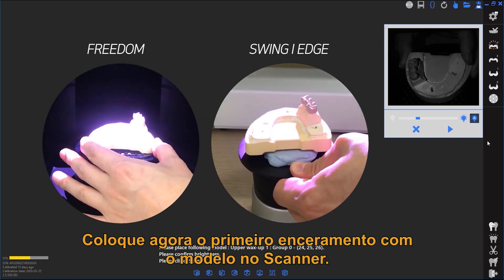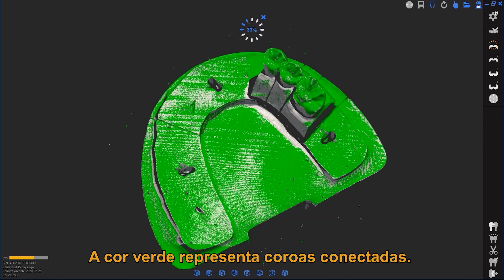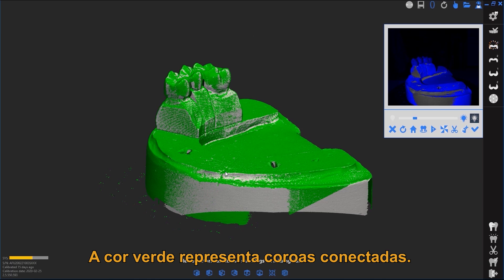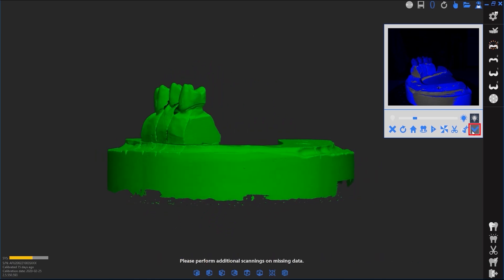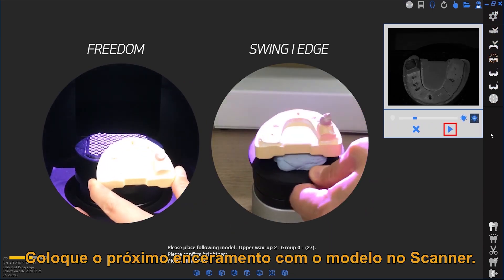Place the first wax-up with the base model in the scanner. Then place the second wax-up with the base model in the scanner.